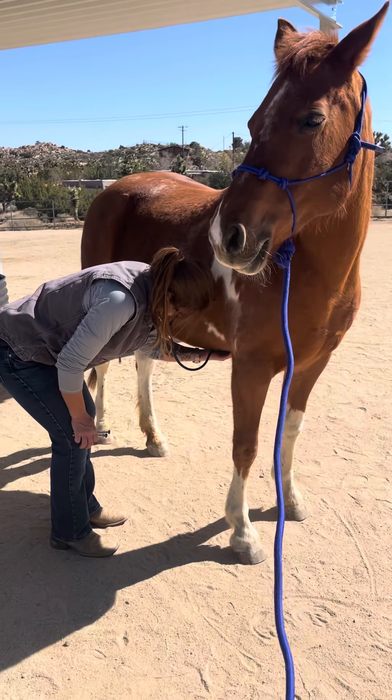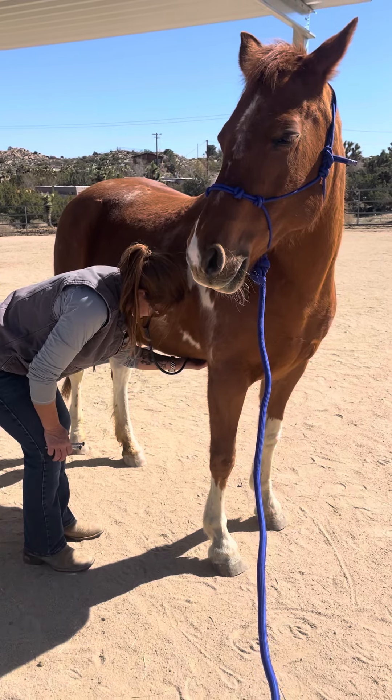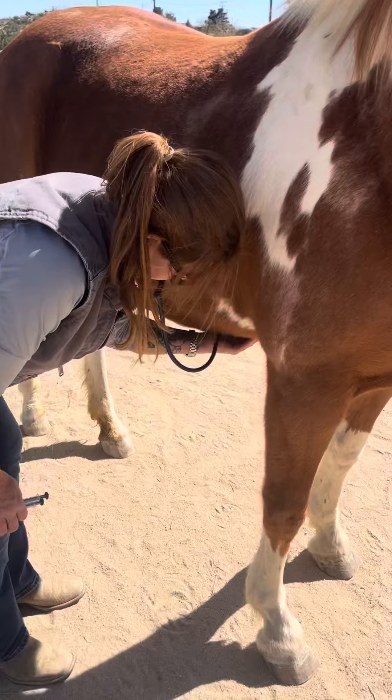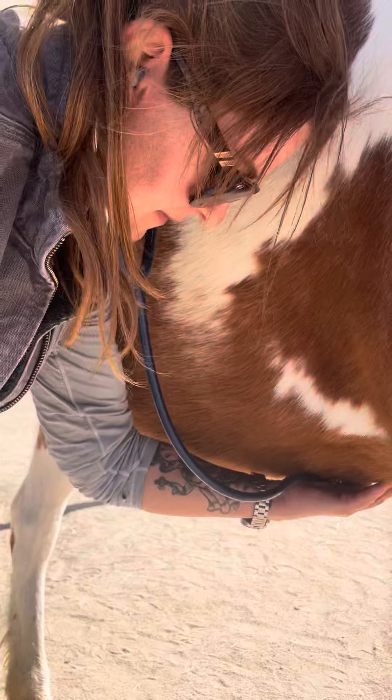This is a video of how to find sand in the gut and how to check your gut sounds of your pony. This is Dr. Morona Petras and she's checking right here. What are you checking for, Dr. Petras?